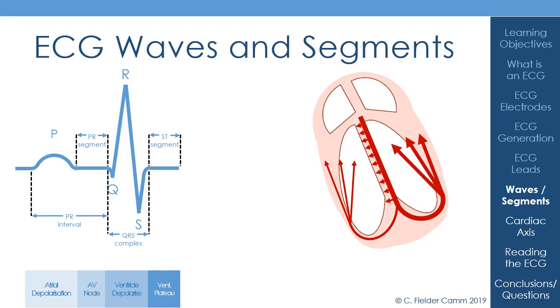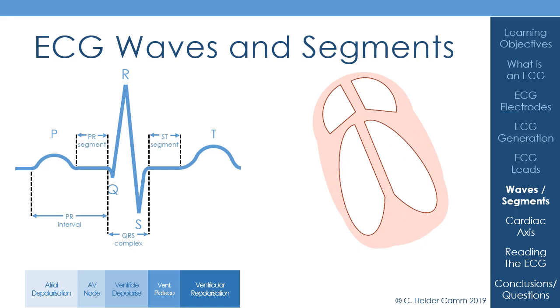So it's the gap between the QRS complex and the next wave, which, as I'm sure you can imagine from the naming, is called the T wave. And this T wave represents ventricular repolarization. Now, the T wave, as you can see, is humped similar to the P wave, so it's difficult to confuse it with the QRS complex.